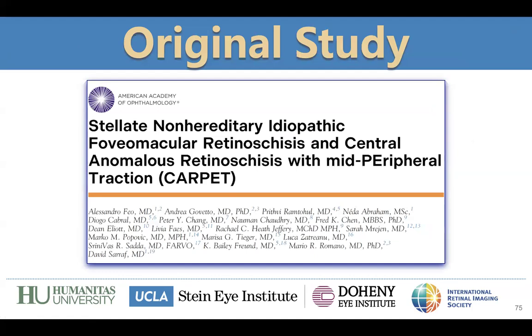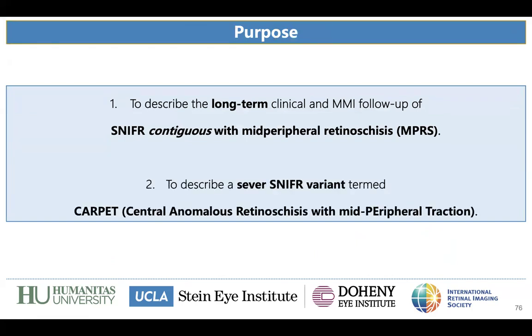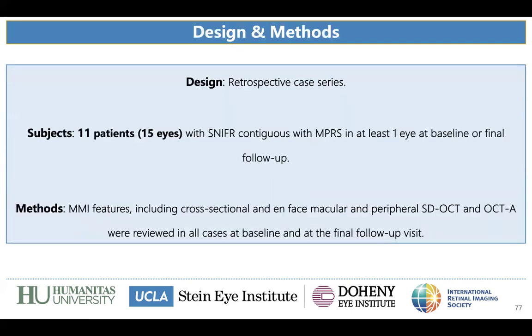So essentially, we used a multimodal imaging approach, including en face OCT, to describe the long-term clinical and multimodal imaging follow-up of SNIFFER contiguous with mid-peripheral retinoschisis. Also, we described a new and relatively more severe variant of SNIFFER that we termed CARPET, central anomalous retinoschisis with mid-peripheral traction. This was a retrospective case series, including 15 eyes from 11 patients.